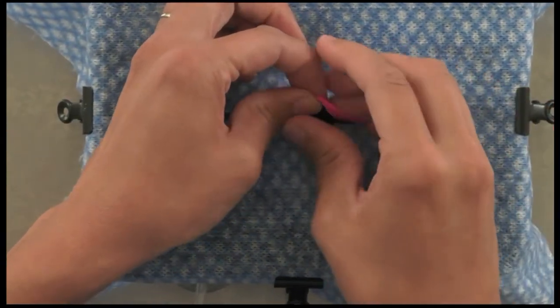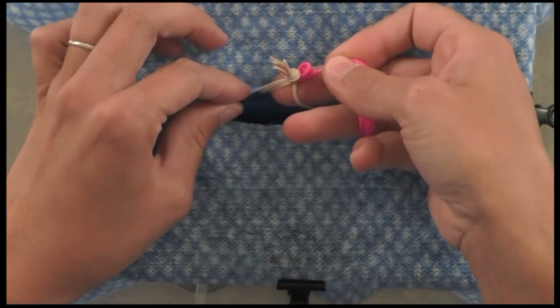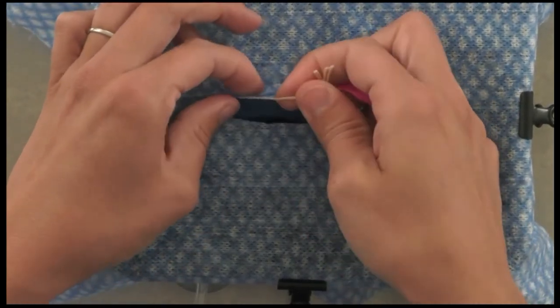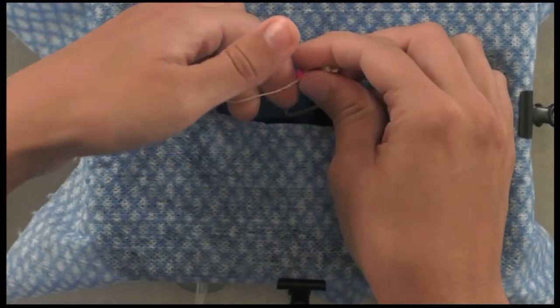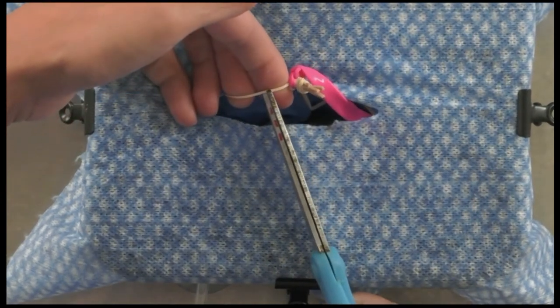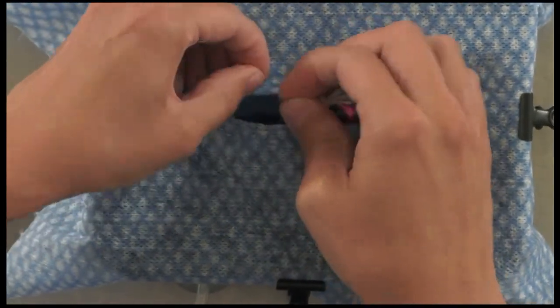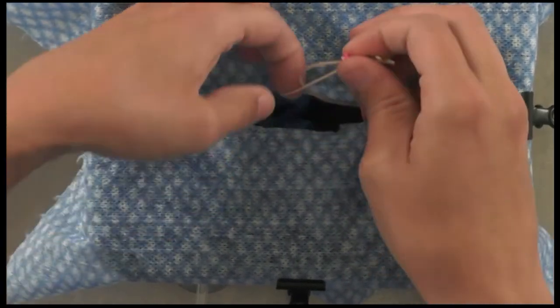Grasp the uterus with your fingers, then walk your fingers up and find the ovary — flip the ovary up. Now find your suspensory ligament; it's the one going the most cranial. Follow it with your fingers. If it doesn't break with your fingers, give it a little snip with scissors partway through the elastic band and then break it with your fingers — that's very similar to the real-life positioning.